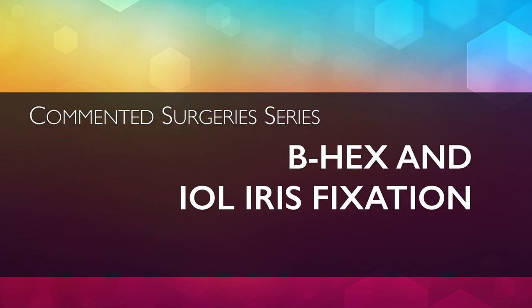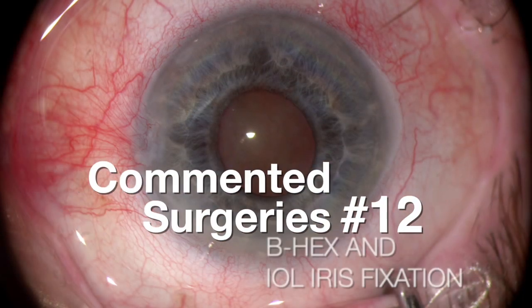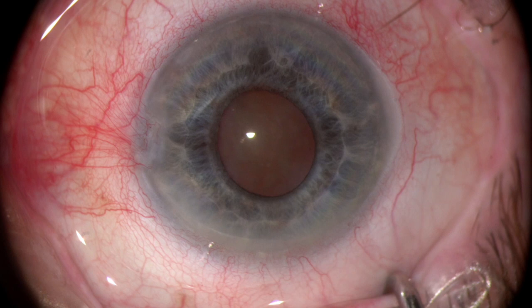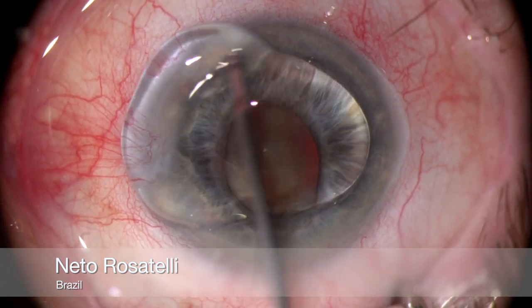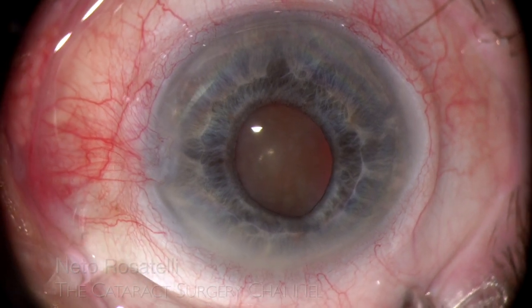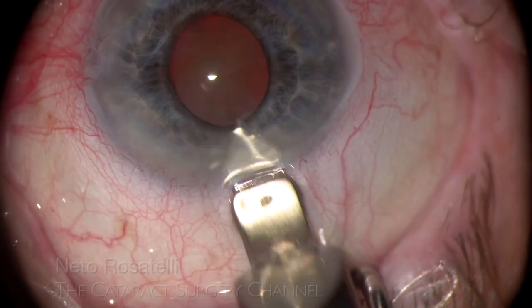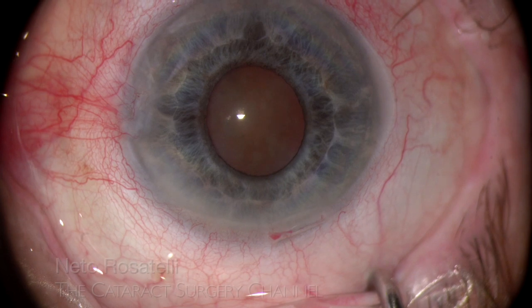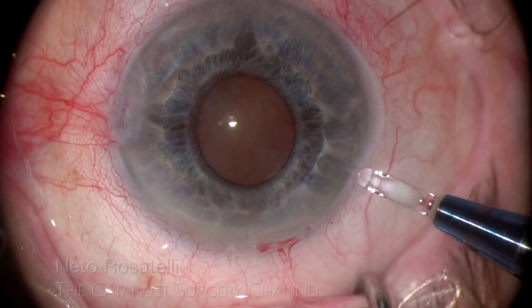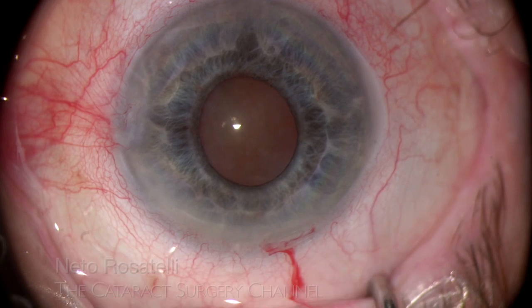Hello, my name is Neto Rosatelli and welcome to the Cataract Surgery channel. This commented surgery shows a very small pupil and loose zonules hard cataract case — three major challenges together, a combination that seems to be a favorite combo at the Mac Cataract Store food menu. The case was approached using the B-hex pupil expander in a bimanual insertion technique that allows for easier and atraumatic pupil engagement, followed by phacoemulsification and IOL iris fixation, making this a very interesting and informative video.